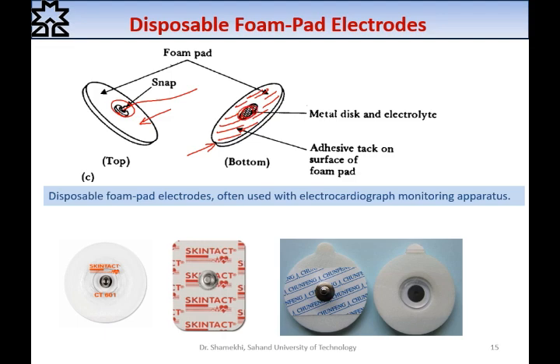And also the main recording part, as you can see here in the bottom view, this is the gel, and also at the center here we have the AgCl part, and it is also covered by Cl negative gel, and also the adhesive part here, and in the top view, the snap to connect to the wire.